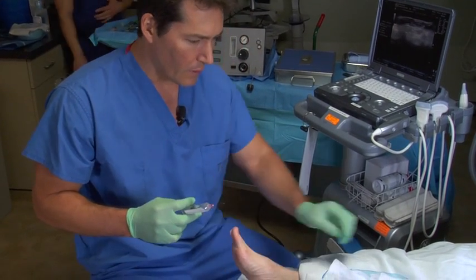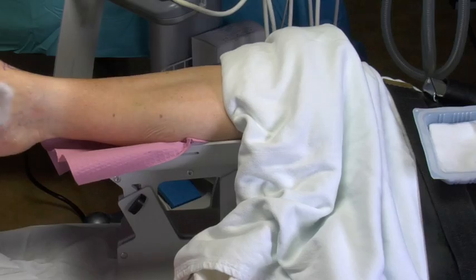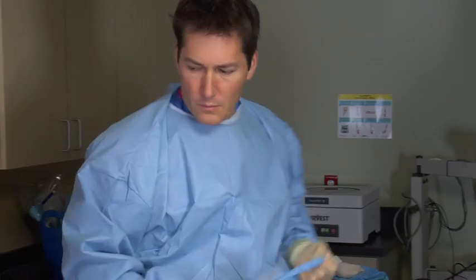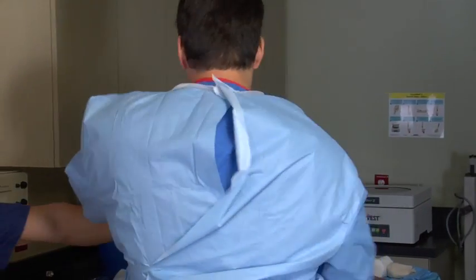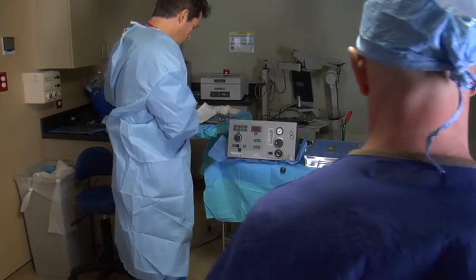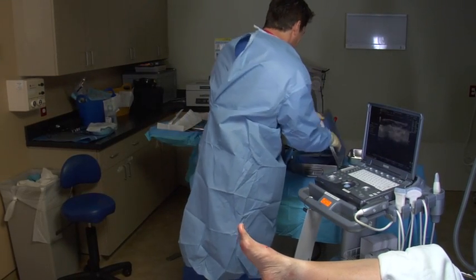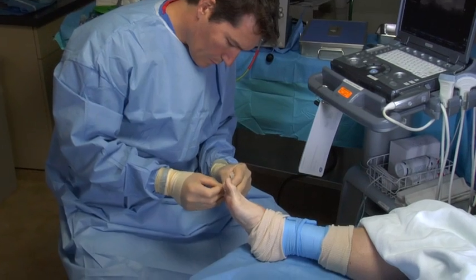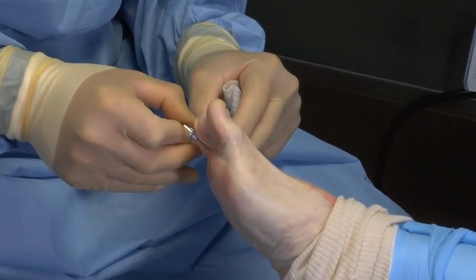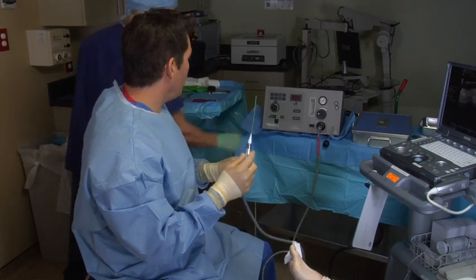In this case, we're applying a small amount of lidocaine to the inner space and using some alcohol to clean off the foot before we start. There you can see the cryosurgical control unit and the diagnostic ultrasound. Now what we're doing here is we're making a very small incision with a 14 gauge needle. And that incision is so small that it very rarely requires even one stitch.